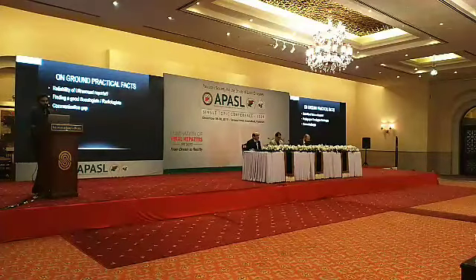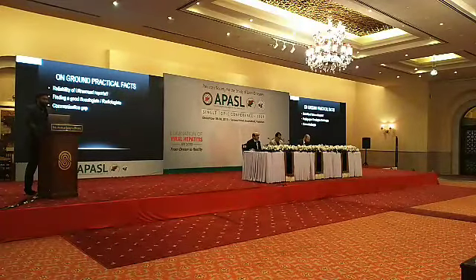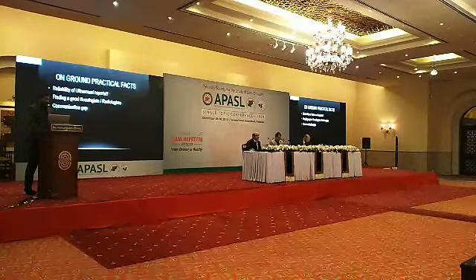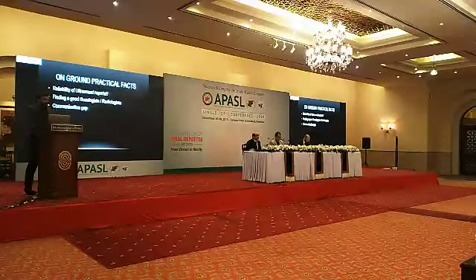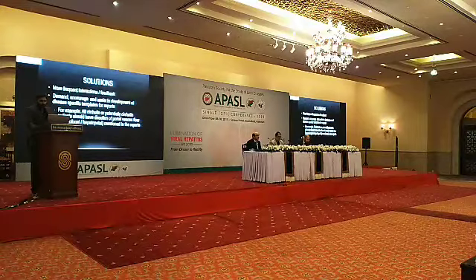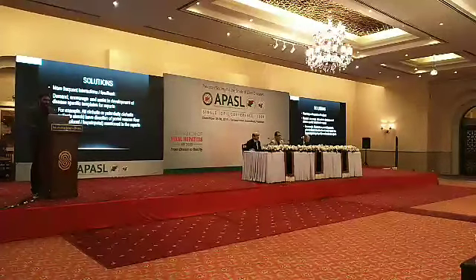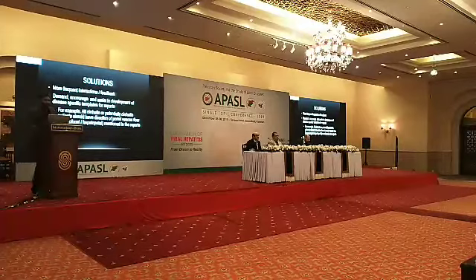So what happens on the ground is, as mentioned before, that the reliability of ultrasound reports in general is pretty questionable. There are few people who do it the right way, few people who have the right equipment, and there is a communication gap between the ordering physicians and the radiologists. What are the solutions that we should be looking into, because ultrasound is an extremely important modality for surveillance, and there is a huge gap in this field.